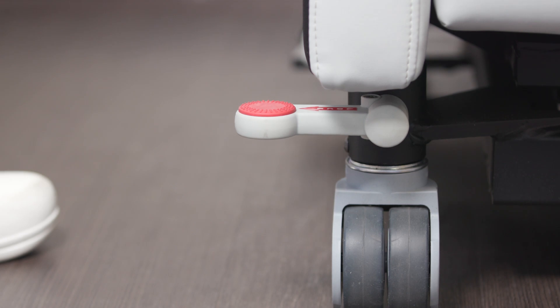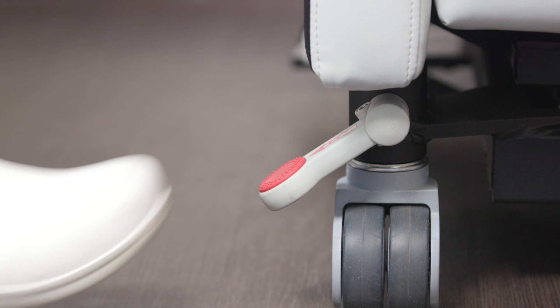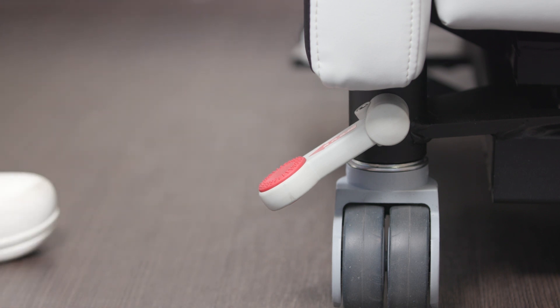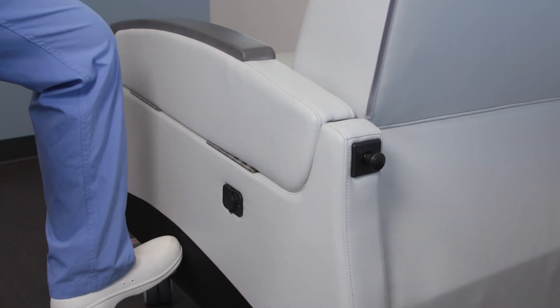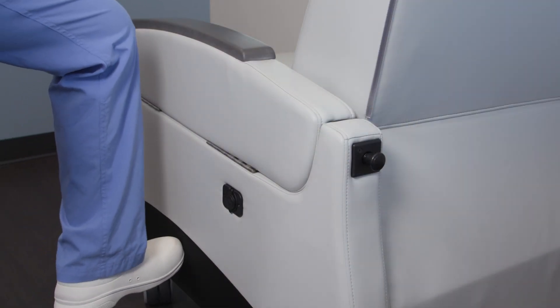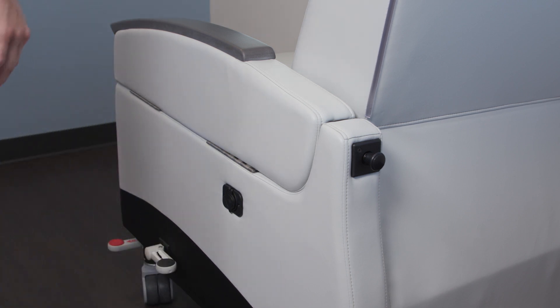The included central locking caster system ensures safety and stability throughout all of the Exam Lift Treatment Recliner's functions, and is operated by a simple press of one of the pedals located on either side of the chair. Similarly, the included Trendelenburg pedal allows the recliner to move past the true flatbed position when necessary for certain medical procedures.